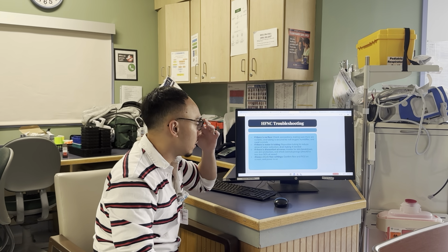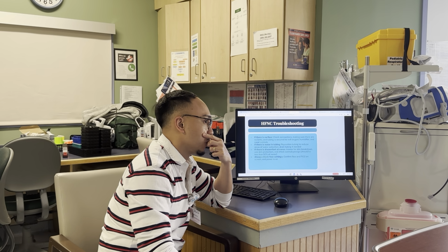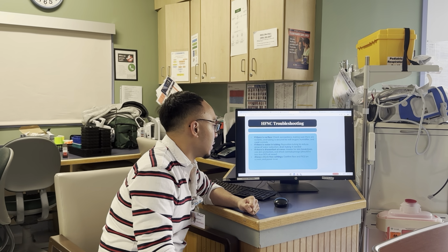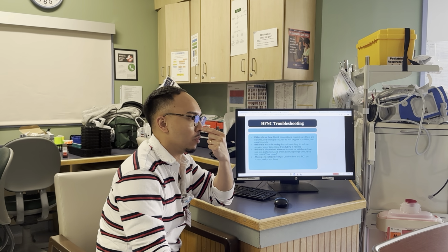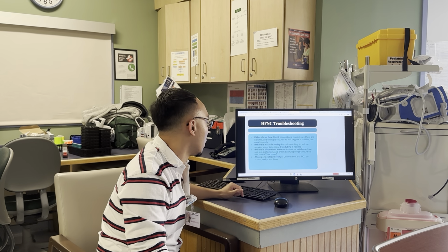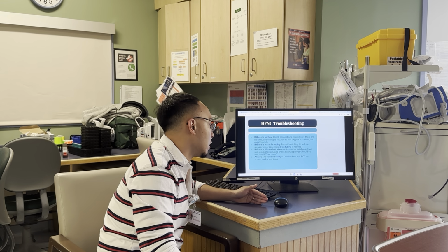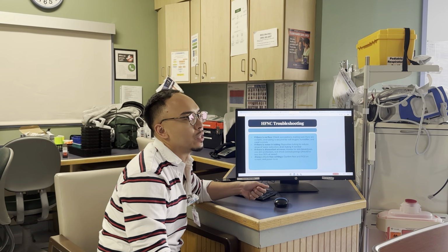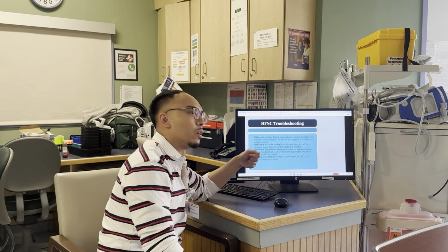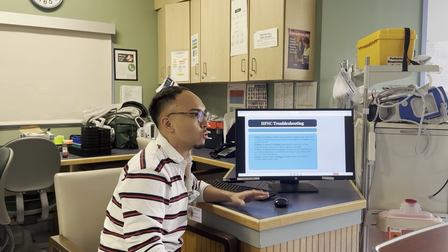If there's discomfort in the nares, you want to assess for skin breakdown. You want to use skin protectors on the cheeks. And then check the cannula prongs. They should be less than 50% of the diameter of your nares. Okay. And then as a general tip, always check the flow settings against the order. Confirm the flow and FiO2 and that the power is on. Sometimes that's usually it. Maybe you have to reset the high flow again. It doesn't hurt if you turn it off and on again. For a 10-second window, that won't damage or hurt the patient.